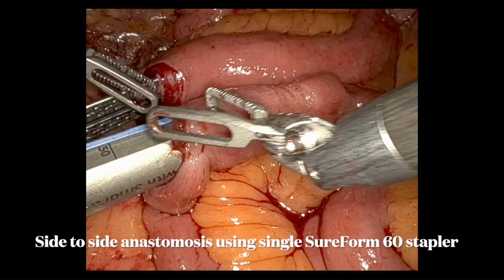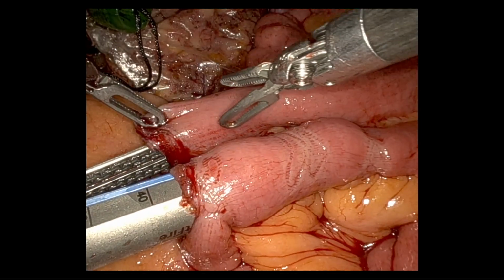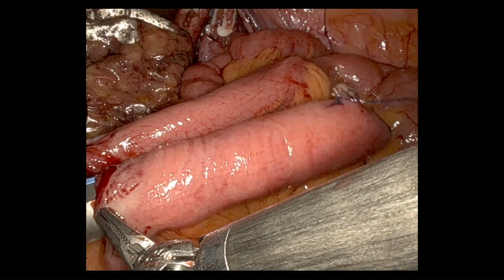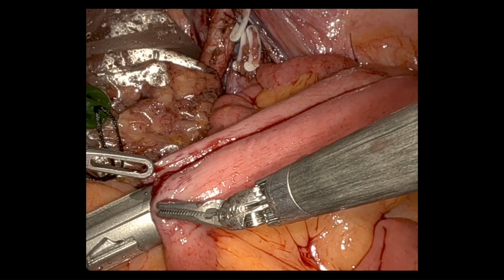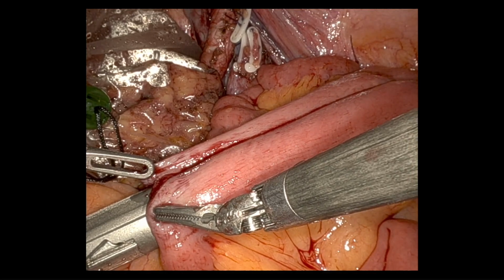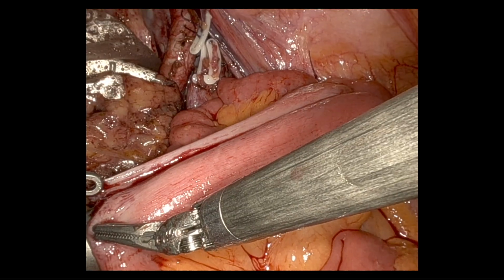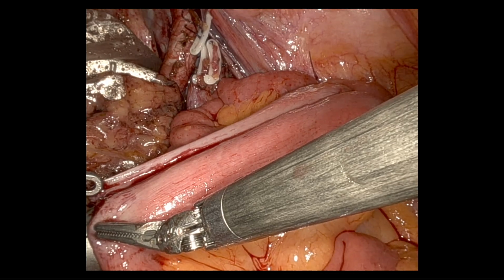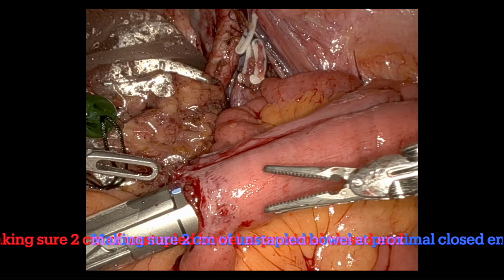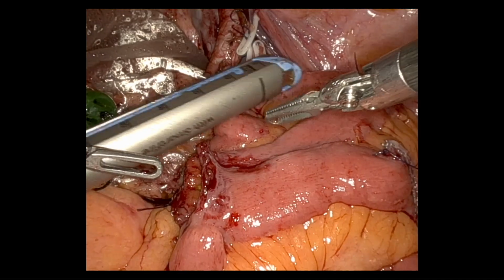Now we pass a single Sureform 60 stapler for the side-to-side anastomosis, making sure that 2 cm of the bowel is spared from the stapler line in the proximal segment to minimize ischemia. Once the anastomosis is completed, you can see that 2 cm of bowel segment is free from the stapler line at both the proximal and the distal divided ends.